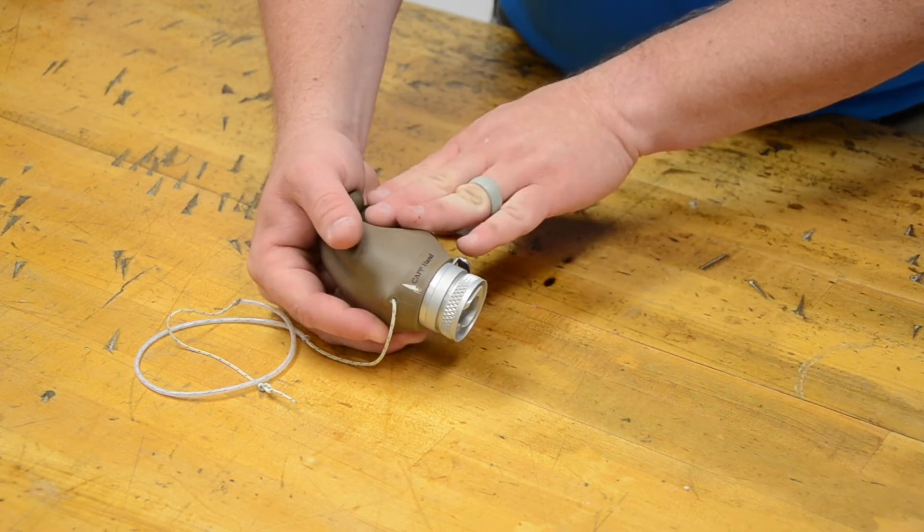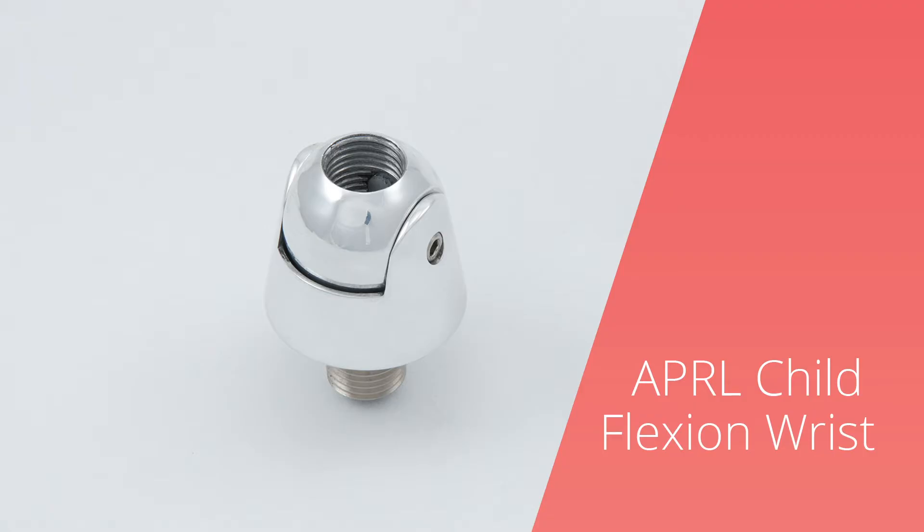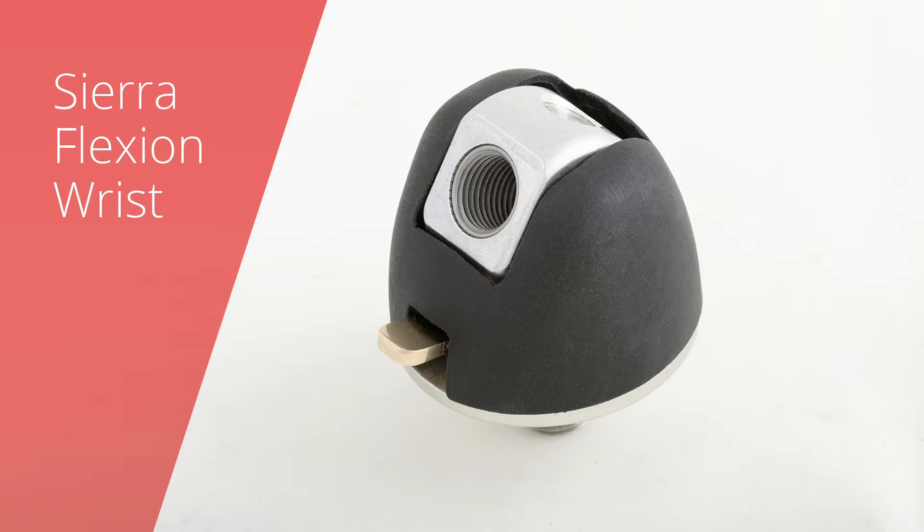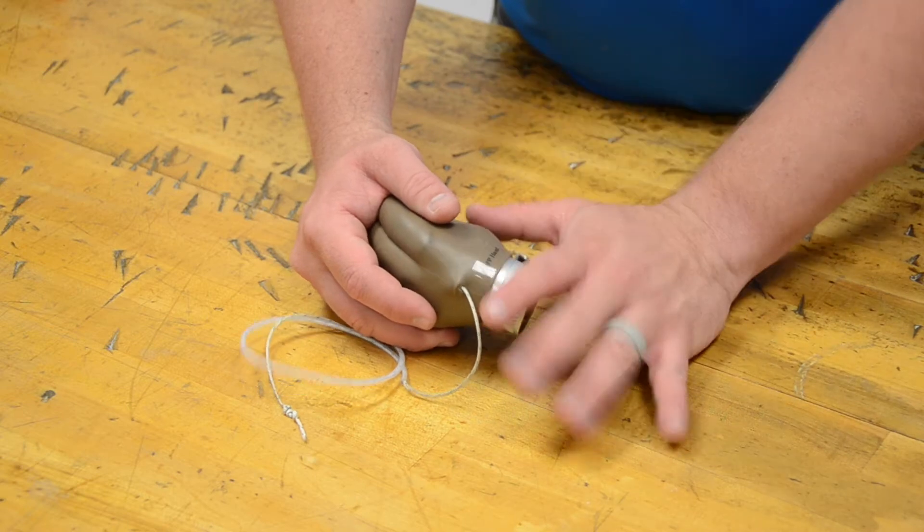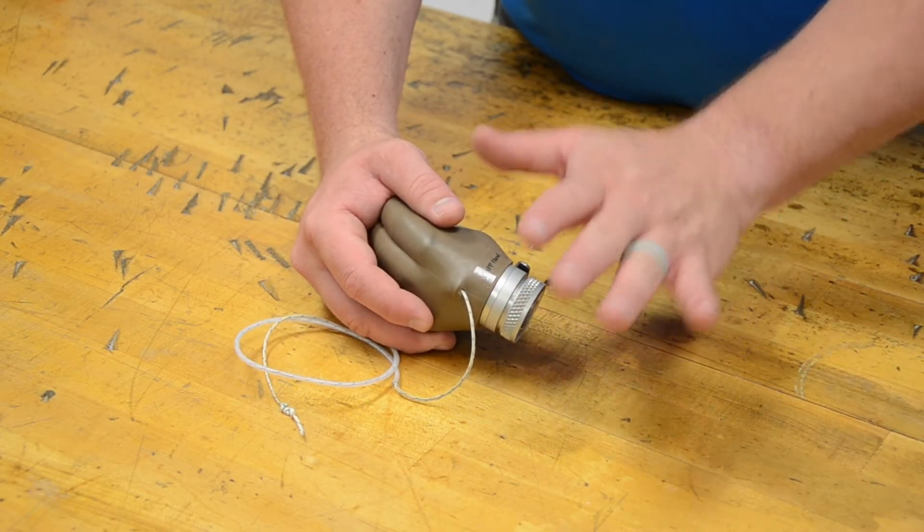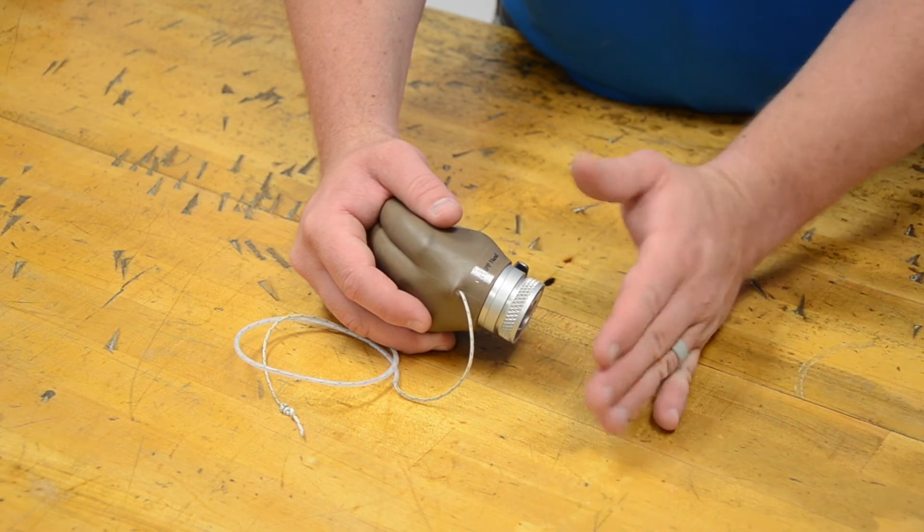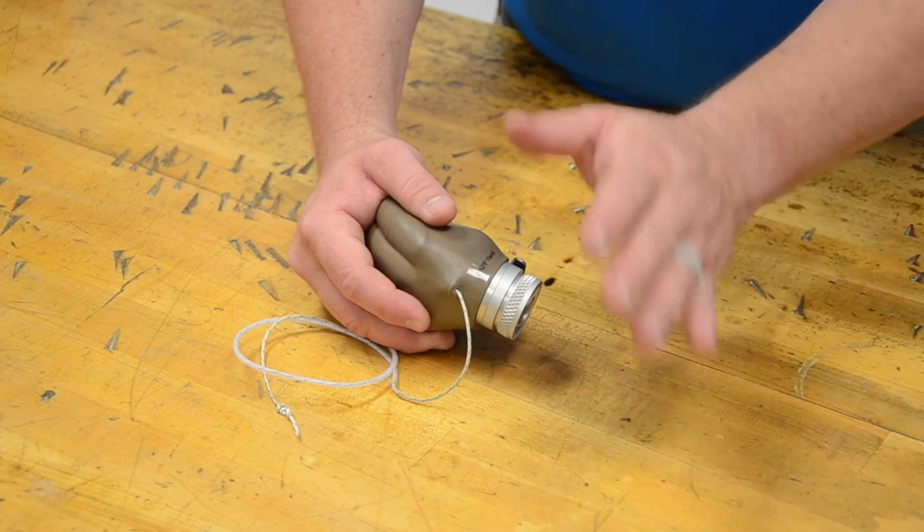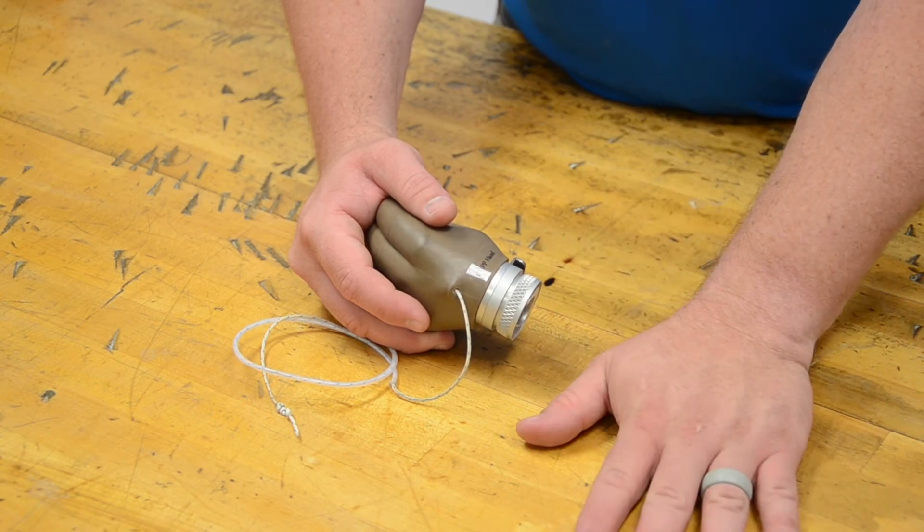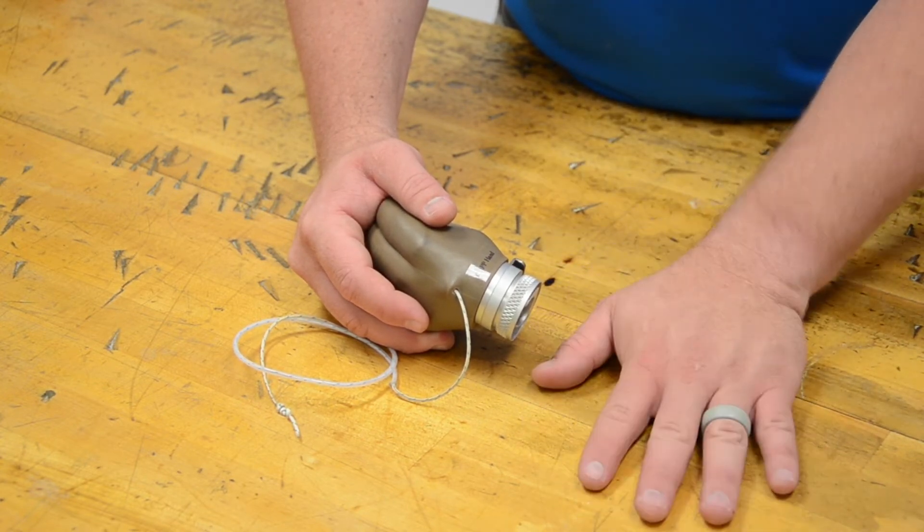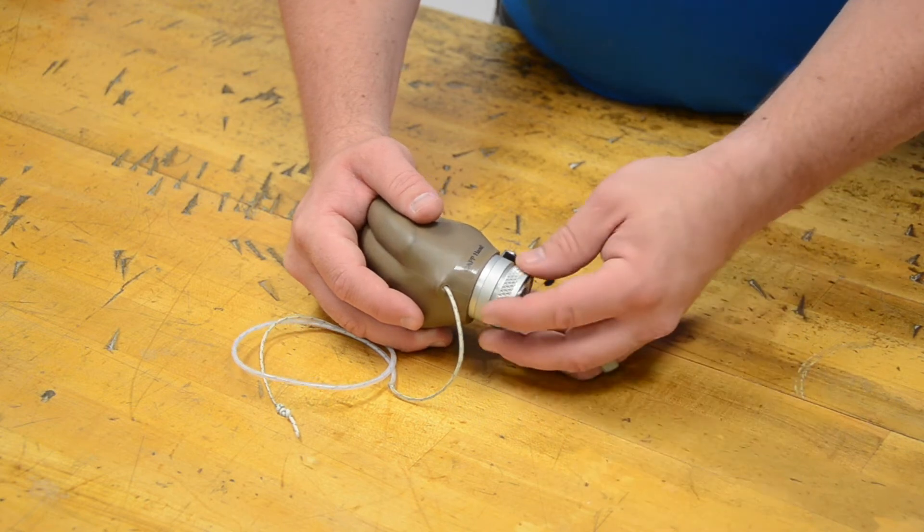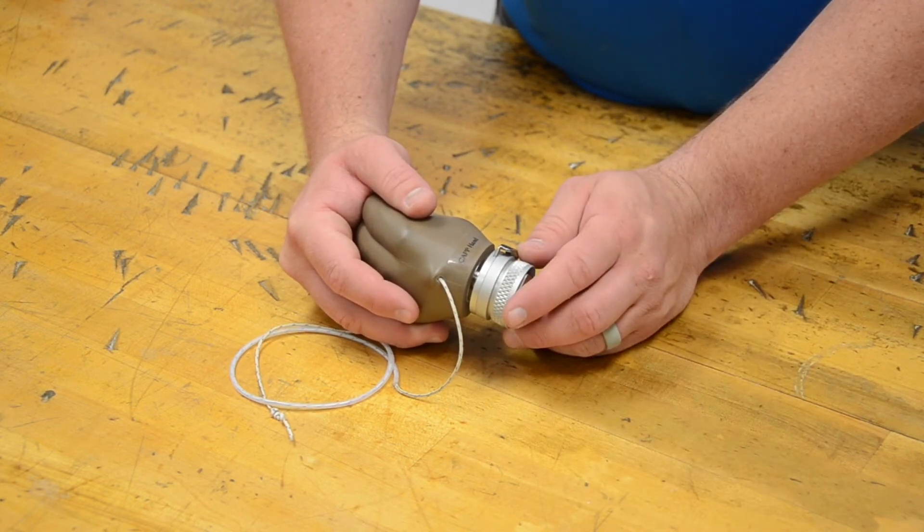If you need to use it with a hand, you'll need to either choose the APRL style flexion wrist for children, which has three ball detent stopping points, or the adult Sierra flexion wrist, which allows the adult to actually use a hand with firm stopping points instead of the ball detents. Remember your Sierra flexion and your APRL are not wrist units in themselves and actually will code separately. You need to pick the correct code for those wrists, which will not be a wrist code, it's an additional body power code. The only flexion wrist will be this FW style flexion wrist.